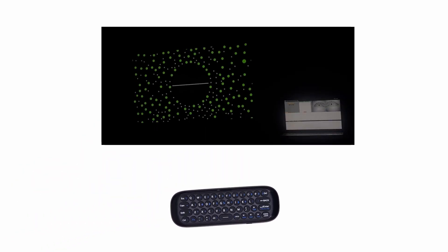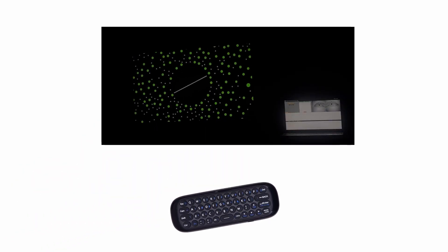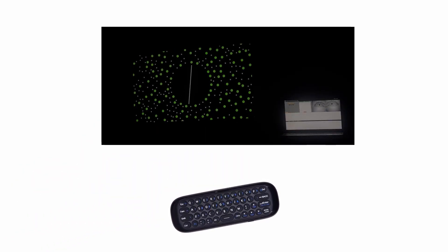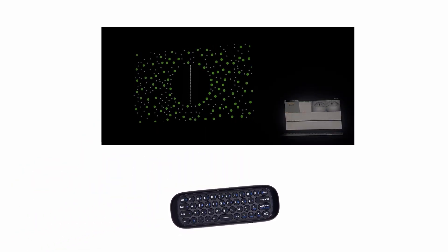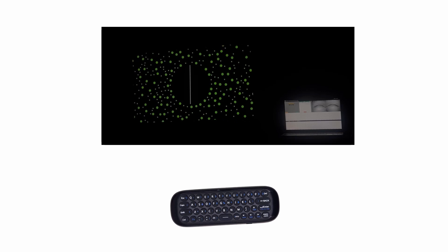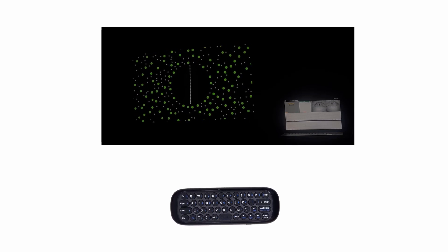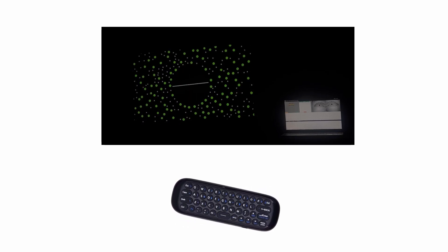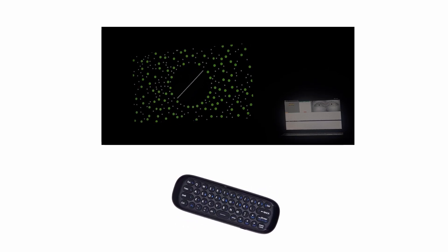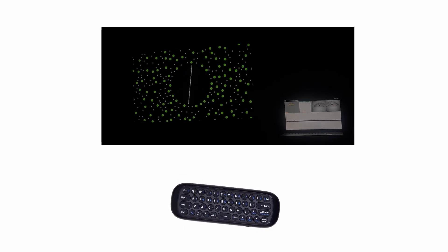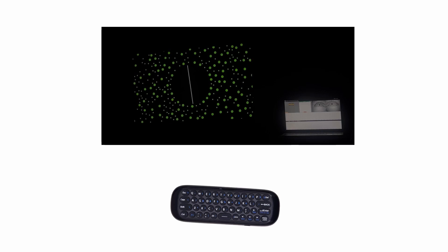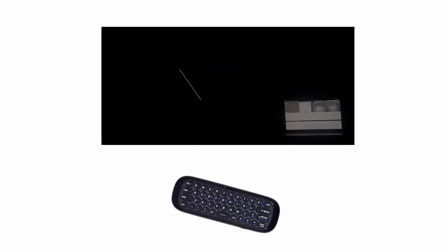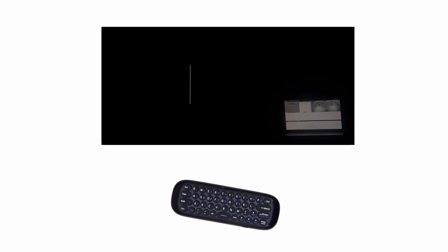Here we see the subjective visual vertical test, where the patient uses the wireless air mouse to align a line to what they perceive as true vertical. This interaction is tracked in real-time by the VNGi software, which records both the adjustment movement and final alignment, delivering accurate, artifact-free results for otolith function analysis.